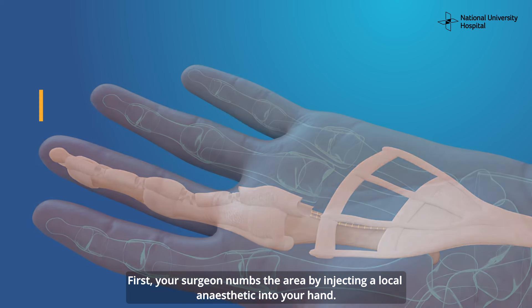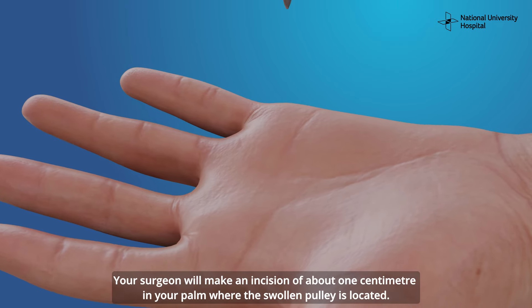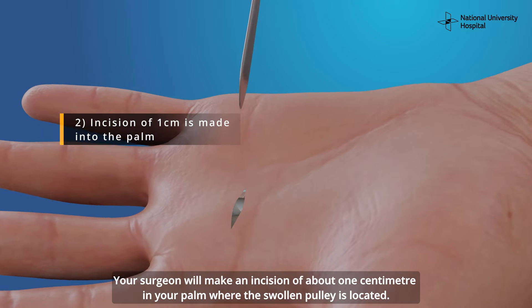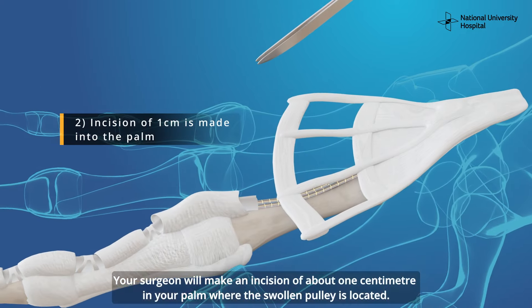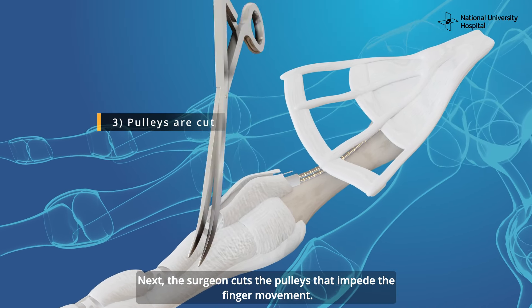A trigger finger release surgery is done to increase the space for your tendon to glide freely again. First, your surgeon numbs the area by injecting a local anesthetic into your hand. Your hand will then be disinfected. Your surgeon will make an incision of about one centimeter in your palm where the swollen pulley is located.